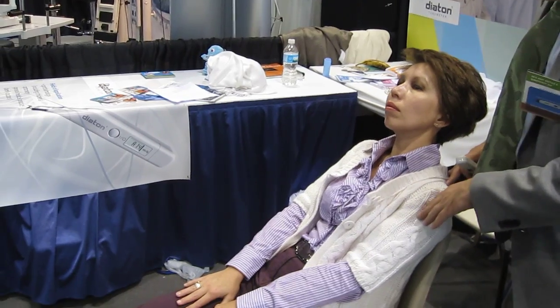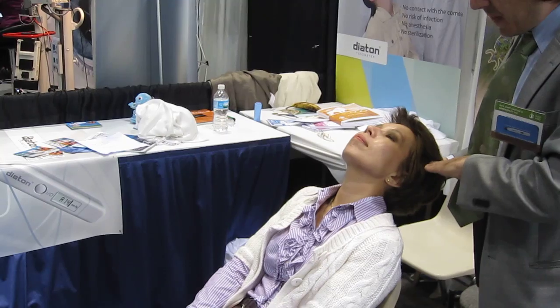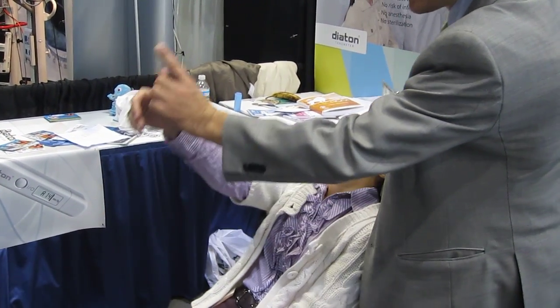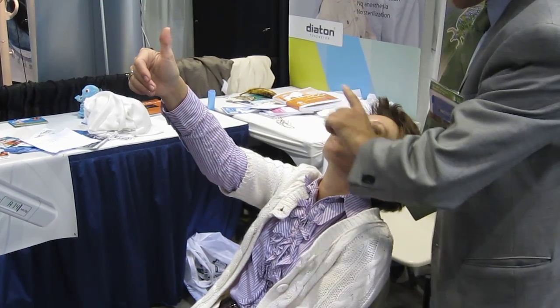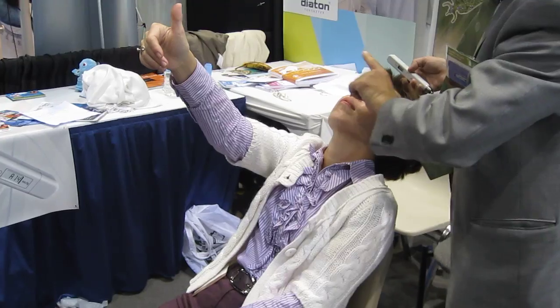Positioning of the patient is quite important. You want to make sure there's some angle on the patient's back in order to have less of an angle on the head. The head should be as horizontal as possible. Extend the patient's thumb in front of them at approximately a 45-degree angle — what we're doing is centering the eye.